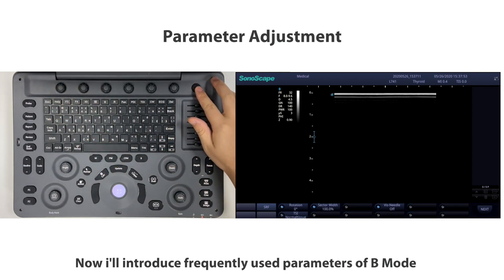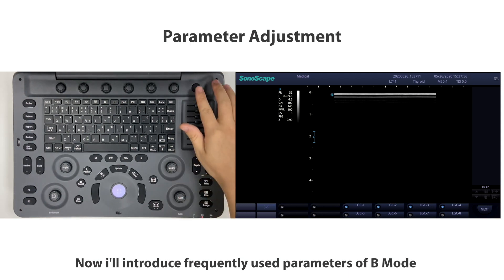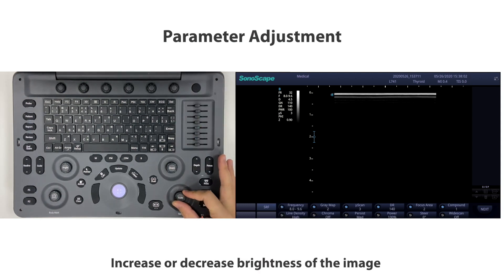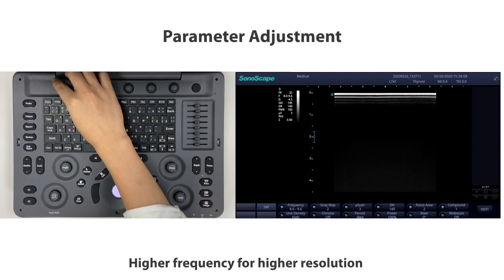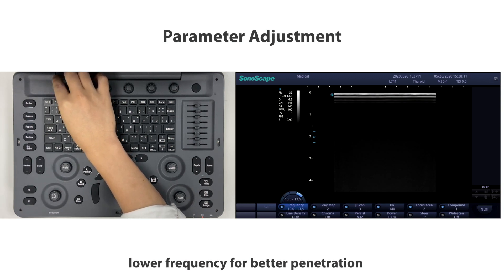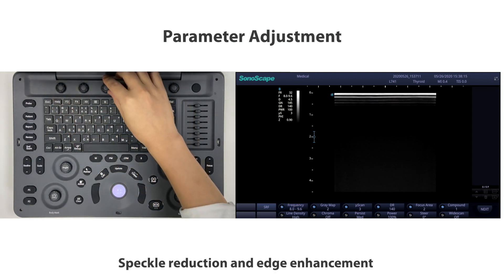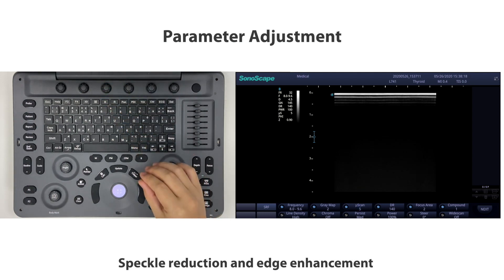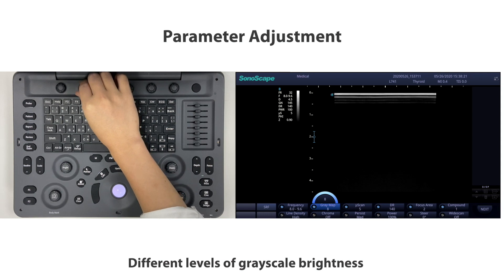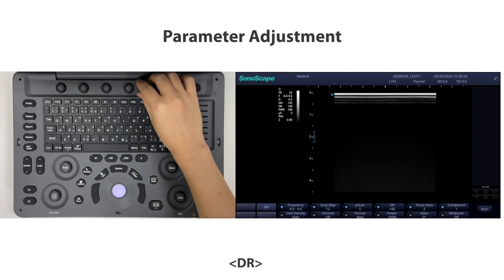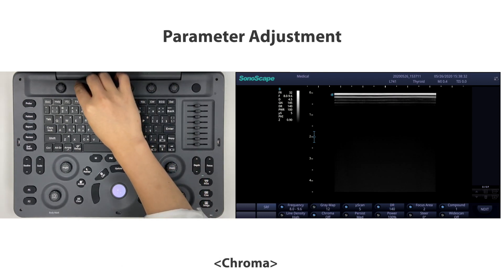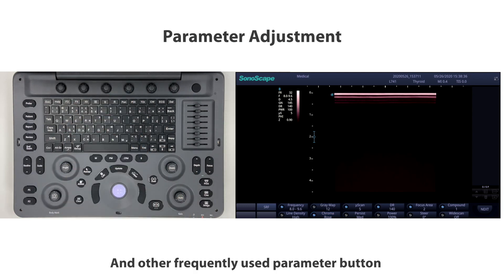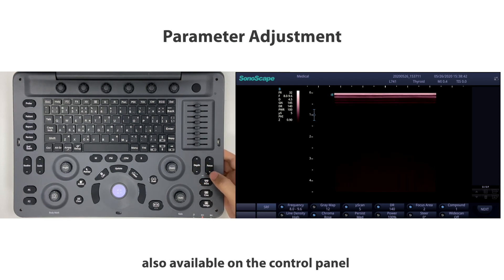Now I'll introduce the frequently used parameters of B-mode: Gain — increases or decreases brightness of the image. Frequency — higher frequency for higher resolution, lower frequency for better penetration. μScan, Speckle Reduction, and Edge Enhancement. Gray Map — different levels of grayscale brightness. DR — higher dynamic range for more detail, lower dynamic range for higher contrast. Chroma — colorized image.